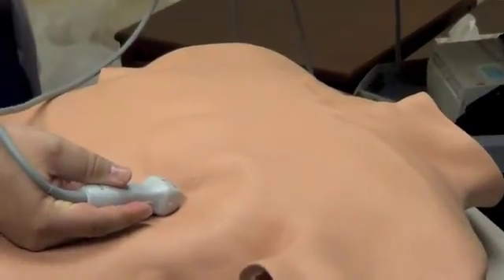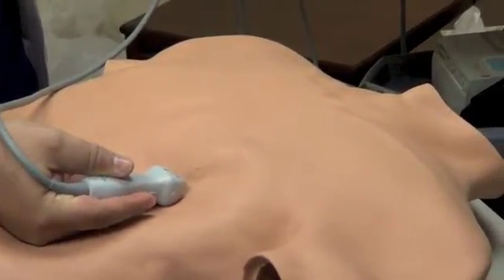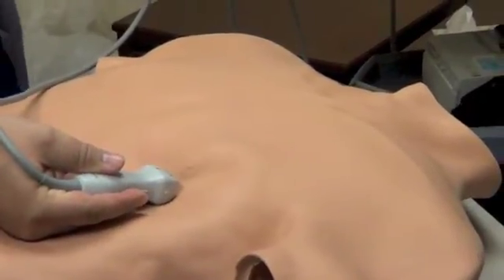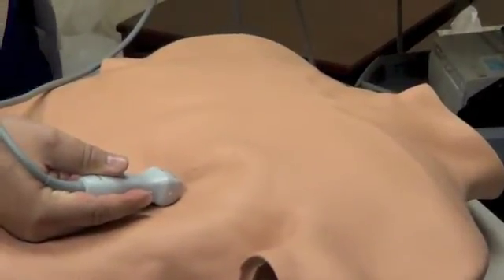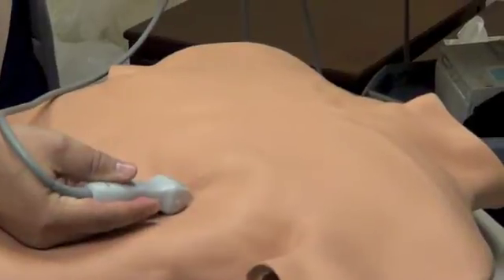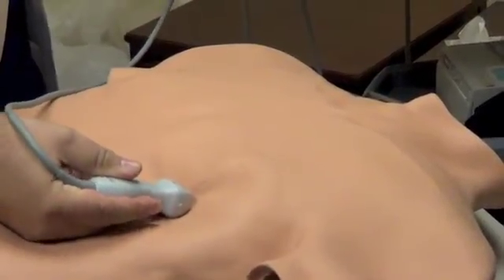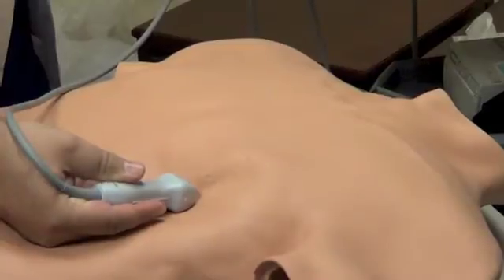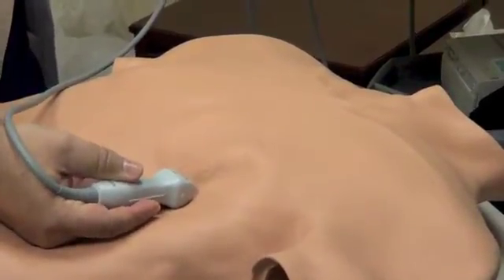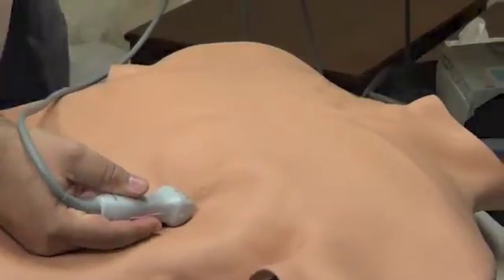What you're looking for here is to see if the diameter of the ventricle has changed. Normally, the left ventricle has higher pressure and a higher diameter. So you're looking for signs of right heart strain, which would present as increased diameter of the right ventricle.